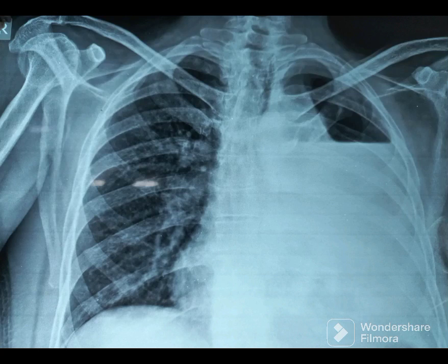Welcome to Chest X-Ray Mastery. You will be provided a few seconds to look at the displayed chest X-ray and make your impression. At the end, we would provide key findings and diagnosis. Your time starts now.